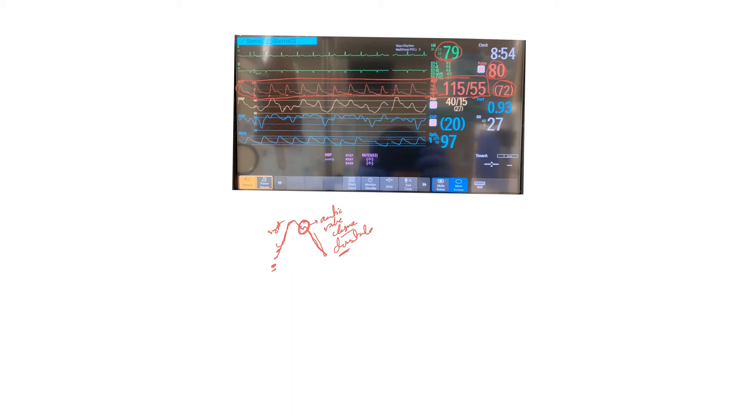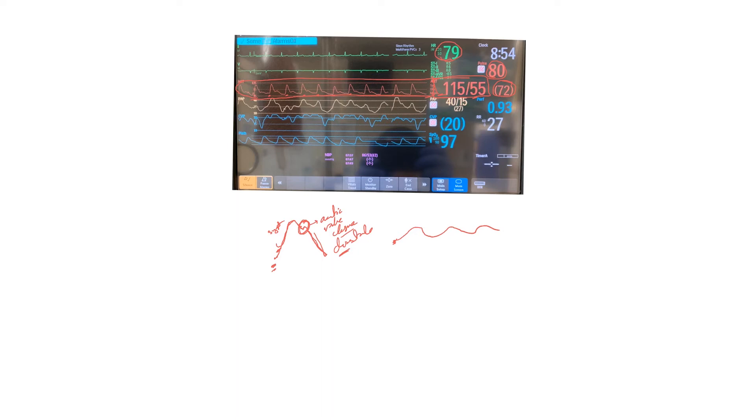You have to pay attention that the waveform sometimes gives you a clue that there is something not right with the arterial line. For example, if you see something like this, this is probably not a right waveform. Sometimes they call it a dampened waveform, and this kind of underestimates the blood pressure.